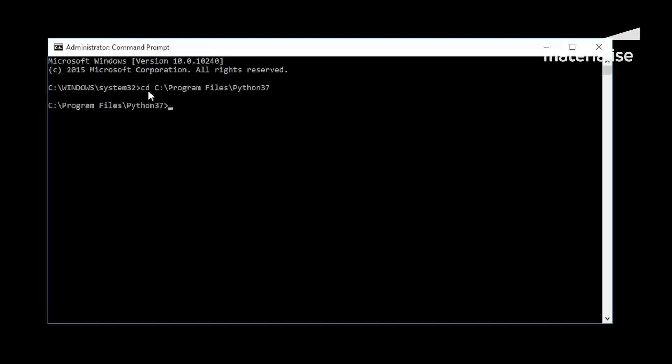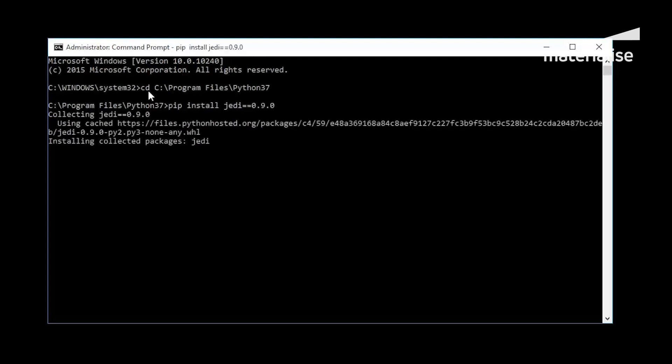Once the command prompt is correctly pointed to the location of the installed Python, please type in the following command as seen on the screen. For the JEDI library, it is crucial that the correct version is used.